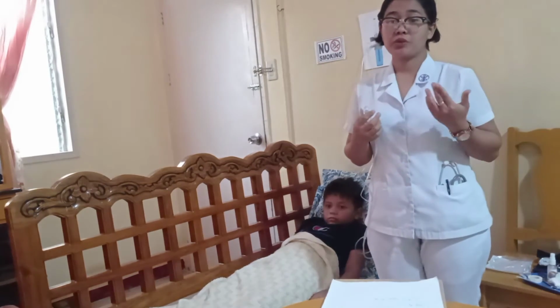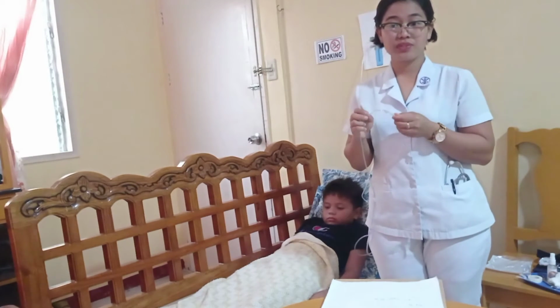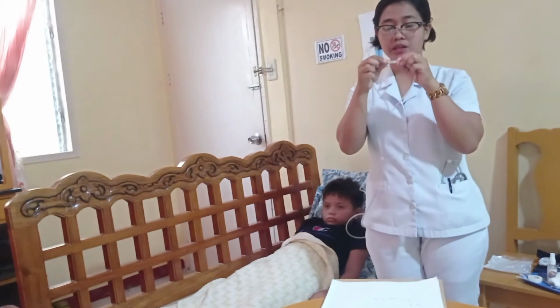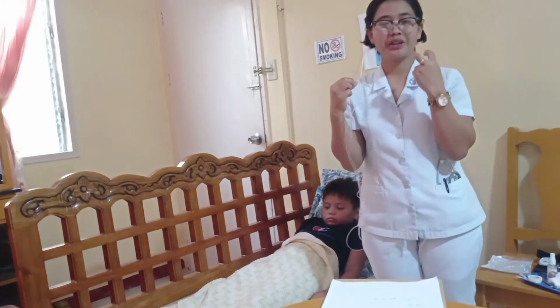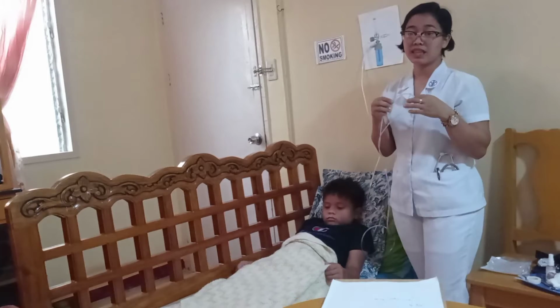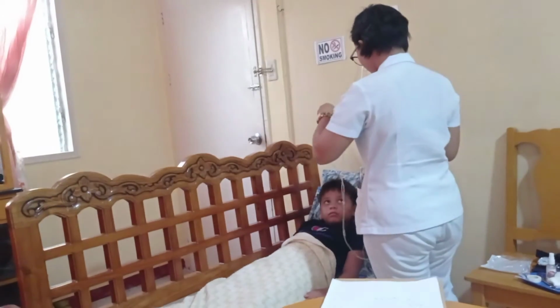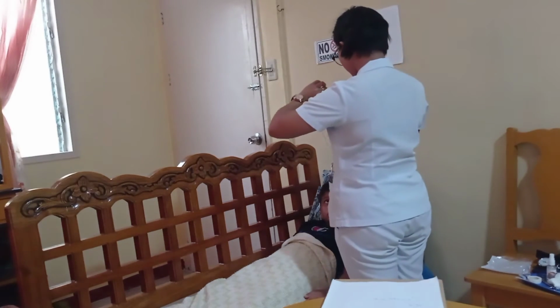And for the application of the appropriate oxygen delivery device, I am going to put the cannula over the client's face with the outlet prongs fitting into the nares. So we have here the outlet prongs fitting into the nares and the tubing hooked around the ears. If the cannula will not stay in place, place it at the side of the face. Sir, I am going to put this nasal cannula on your nose, okay?